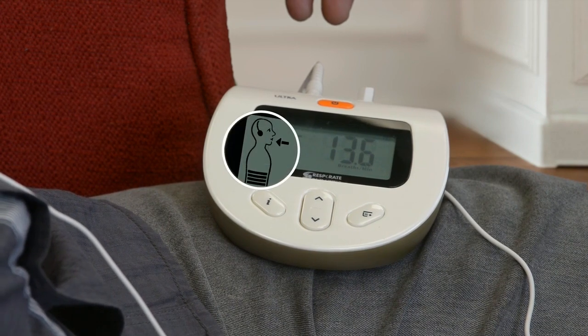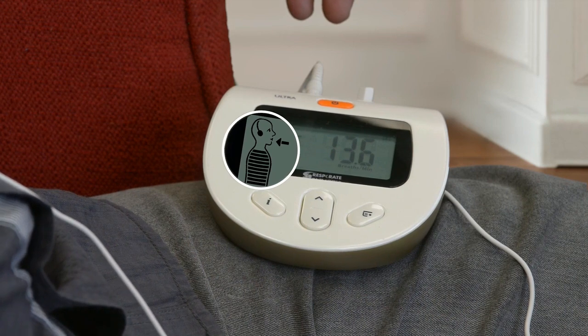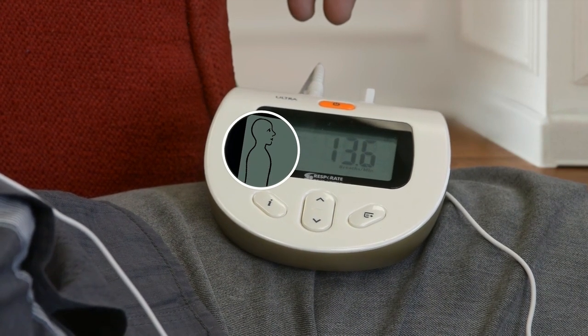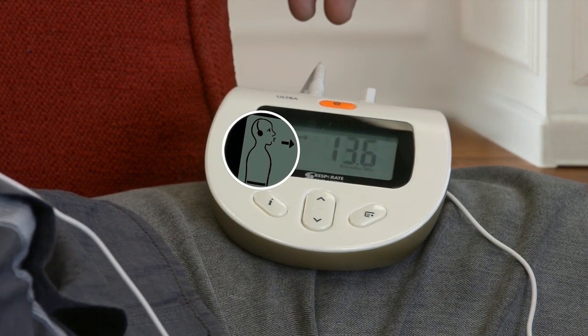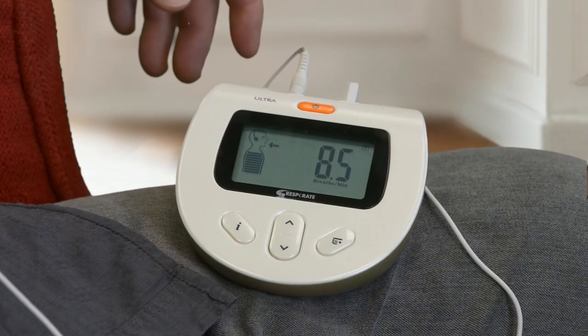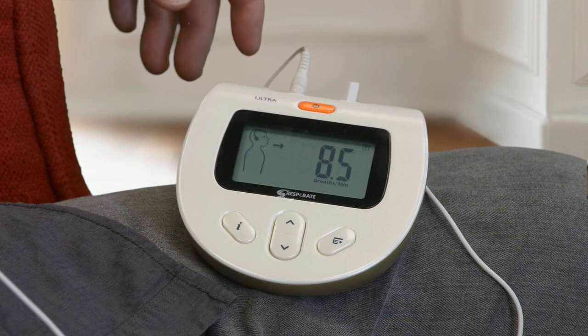This tone is the breathe-in guiding tone. This tone is the breathe-out guiding tone. Now, lean back and breathe according to the guiding tones. Breathe in. Breathe out. In. Out. Continue to breathe with the guiding tones. Great. Your breathing movements follow the guiding tones well. If you would like to repeat this part, press down now. Otherwise, press up to continue.